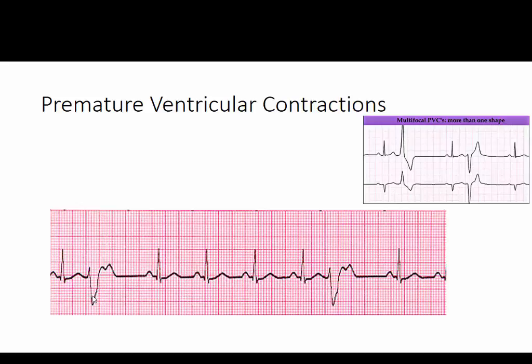And again, if you become symptomatic with them, like short of breath or dizzy, or an unusual feeling that you're not used to, then you should get them evaluated. But in most cases, they're benign. Just look for those wide, kind of isolated complexes. But other than that, there's a normal rhythm going on there.